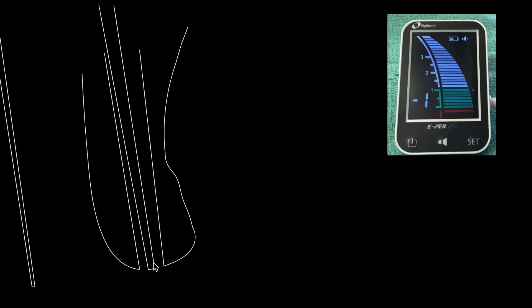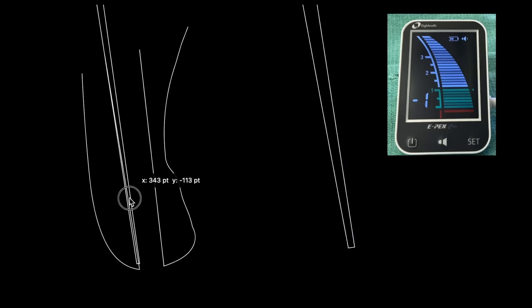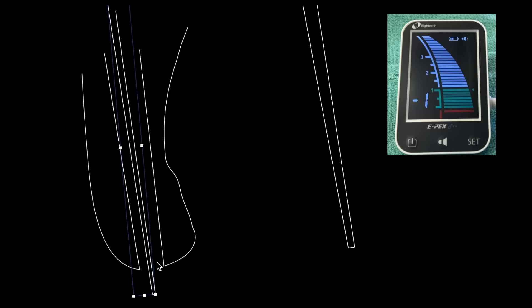Using a larger file decreases the time you waste trying to figure out working length because otherwise it becomes very random. If you're doing root canals routinely, you should have a set of larger hand files just to establish working length. You can also use your rotary files for that. Otherwise you'll just run the file down — you can see how large this canal is — and when you go to fit your cone, it'll likely be long.